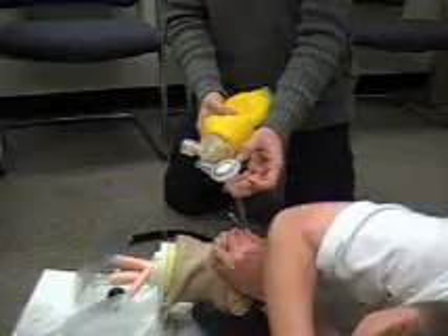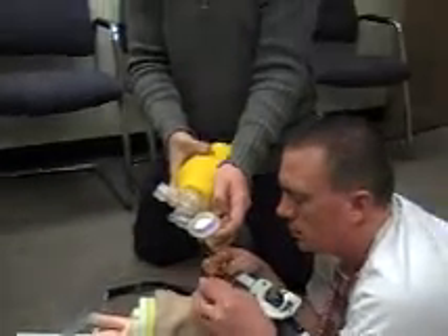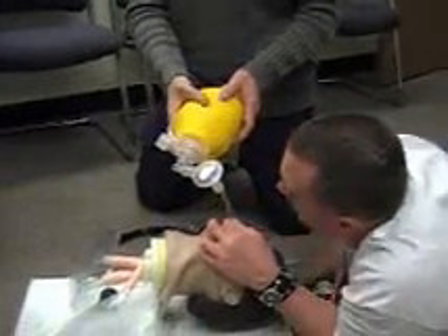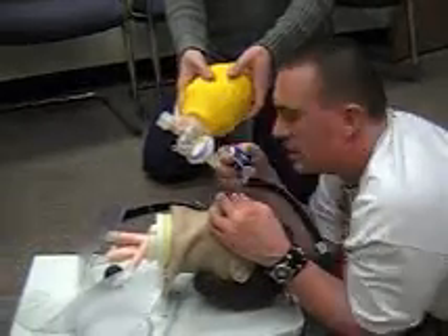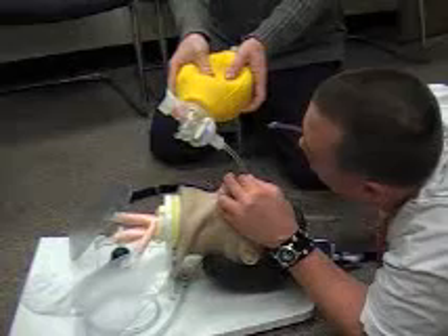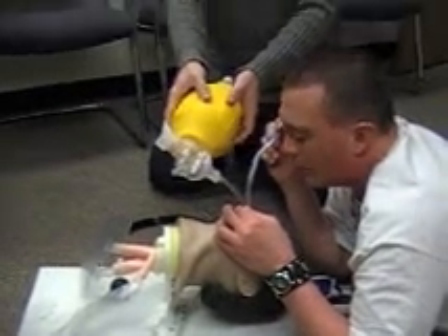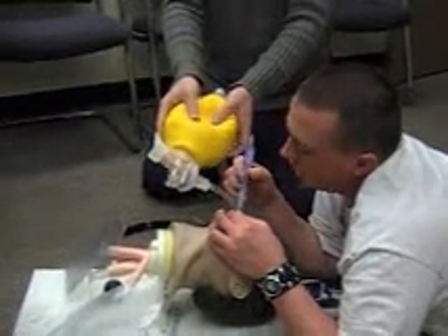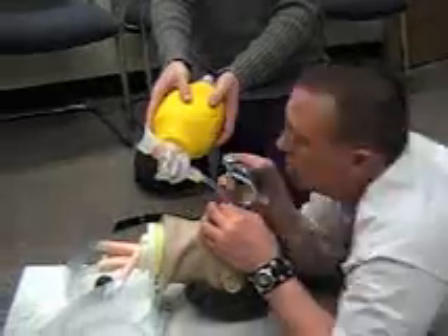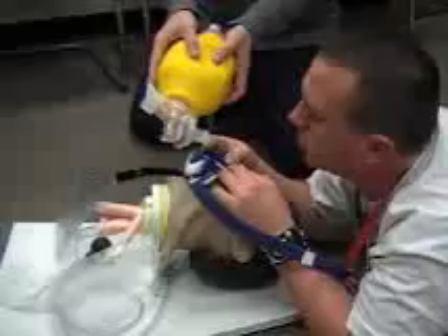I'm going to have my partner continue to bag, holding the tube and not releasing it, and I'm going to secure it using my Thomas tube holder. If I notice any secretions, vomitus, or anything else in the airway, I can use my suction. I would use a Yankauer for an adult or a soft French tip for a pediatric patient. I'm going to insert the suction and suction on the way out for no more than 15 seconds. I'll then take my Thomas tube holder to secure my tube.